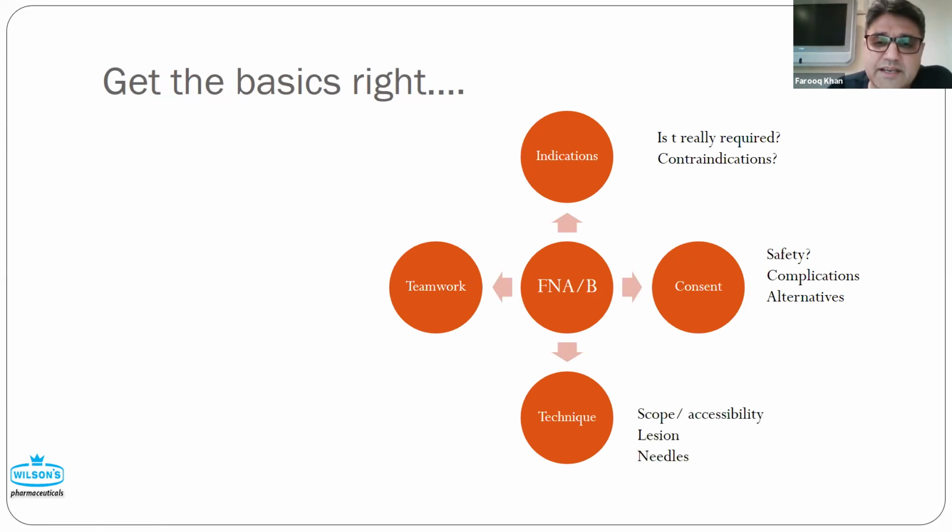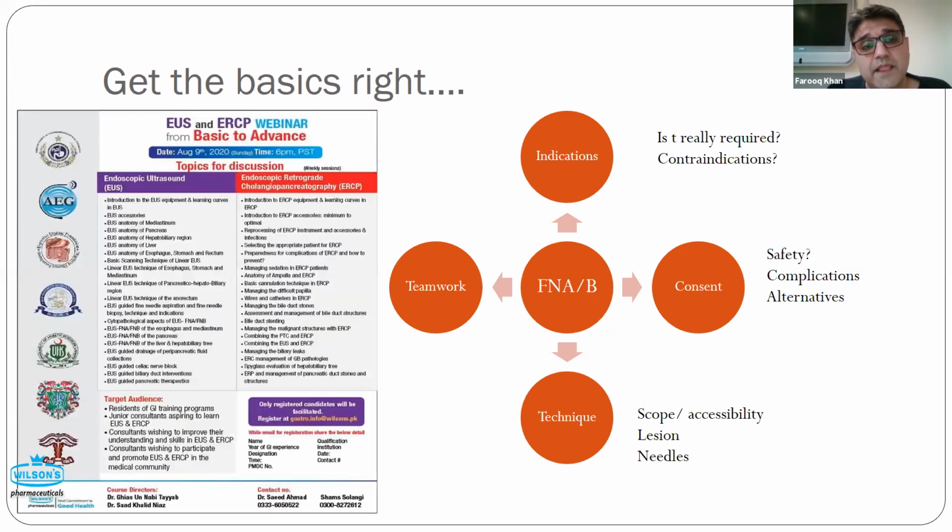I think what's also worth mentioning is the technique, and there will be a couple of slides that will cover the technique in detail, but largely what the technique comprises of is scope, the accessibility, what the lesion's looking like, and what needle am I going to use. But I left the teamwork in the last, and I think we must not forget that teamwork, by and large, in any skill that you're going to learn or you're going to perform, is going to play a major role. And a very essential part of teamwork is workforce development. Now, this isn't just about learning yourself, it's about preparing your nurses in the unit, preparing your technicians in the unit.